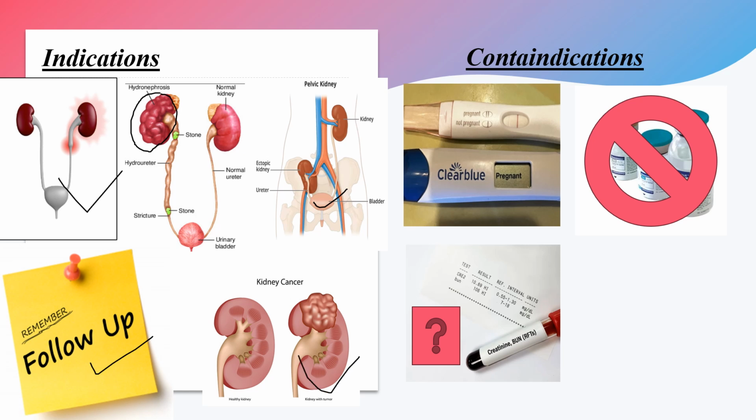Now the contraindications. If you are pregnant, it can be a contraindication to CT urography. If you are allergic to the contrast media, then it is also a contraindication to CT urography. And renal impairment, that means abnormal creatinine and BUN report.